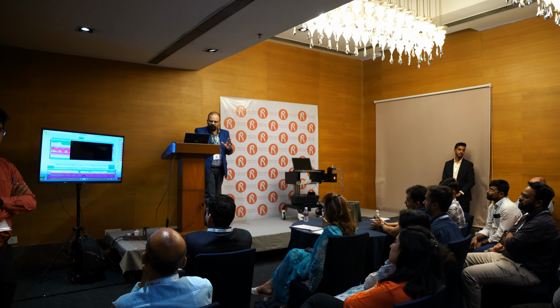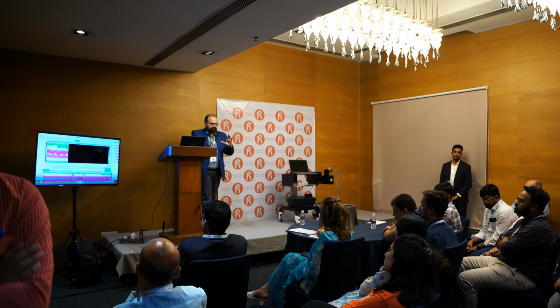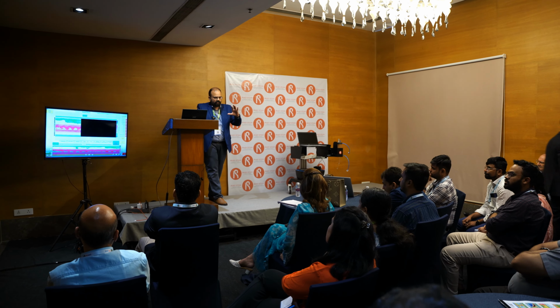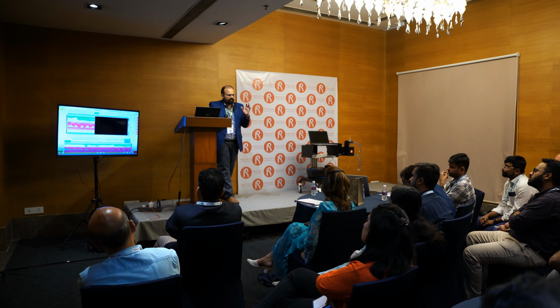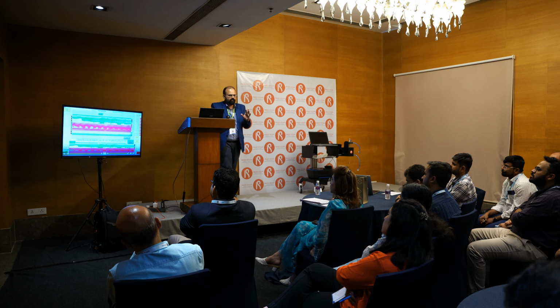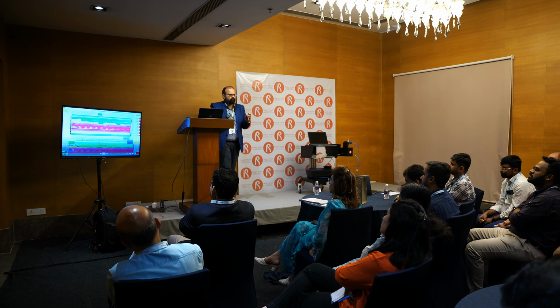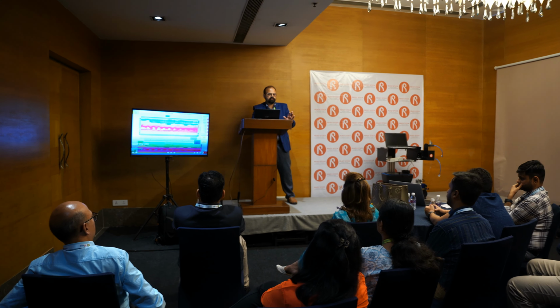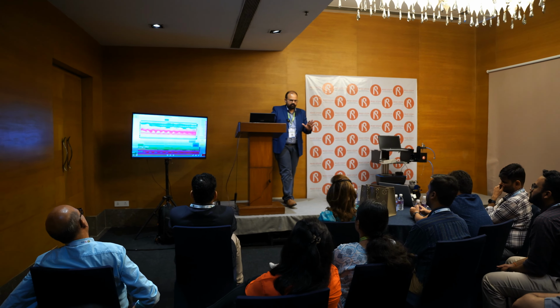So where do I place the catheter? As you can see, all the catheters have an area which has a maximum number of sensors, a high density of sensors. That's where my maximum area of interest, whether it is an esophageal manometry or a rectal manometry, should come. So my anal sphincter should come in this particular area where the maximum number of sensors are. That is the first basic thing.